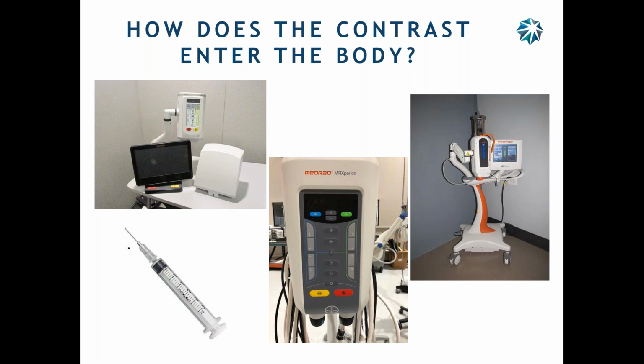Has anyone seen a contrast injector in the hospital? It's caked white, isn't it? A lot of white on it. Yeah, it's worse than super glue. It just gets on there and stuck, and you can't get it off. And the only thing that gets it off is what? Hot water. Okay. I had someone say, "Can I use a steamer on it?" Sure. It just rolls right down into the other stuff. You're not cleaning it off.